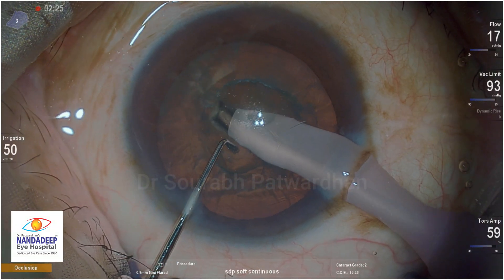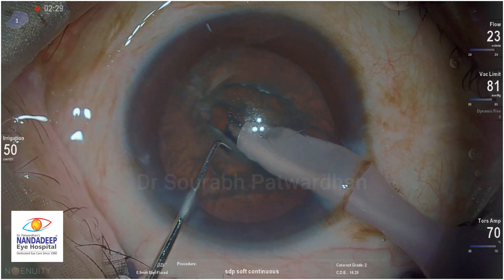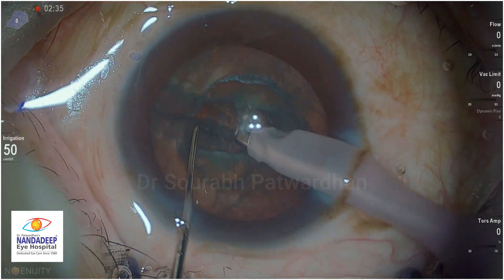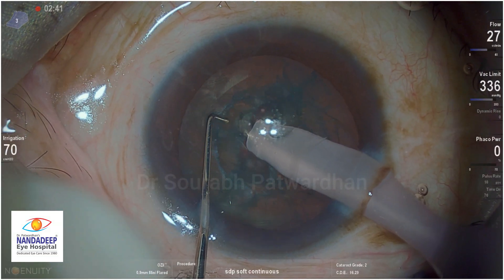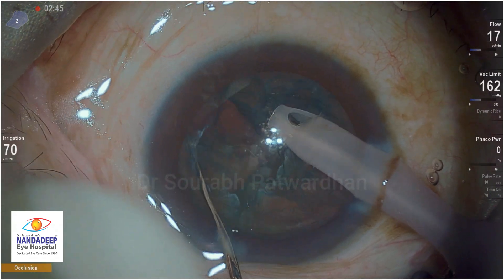So I didn't want to do phacoaspiration here but decided to do the trench divide technique. A deep trench is a must right at the center of the nucleus. Many times I saw my trainees do a trench but which is not at the center, and usually if it is not in the center, you may have a little trouble in dividing the nucleus. Now I am trying to do a chop here using the Constellation phaco.